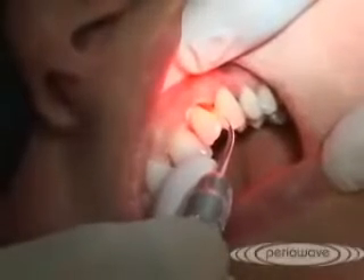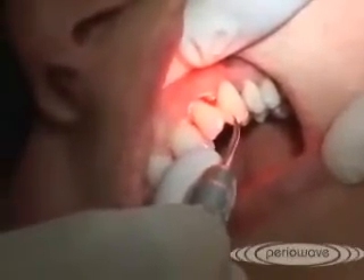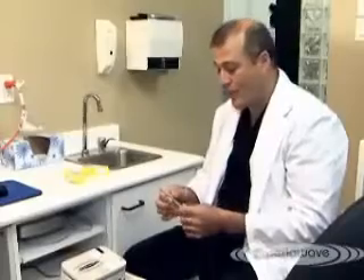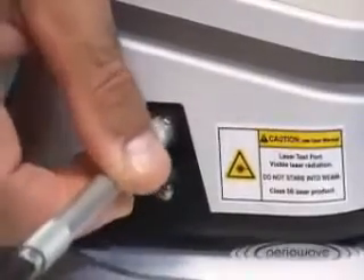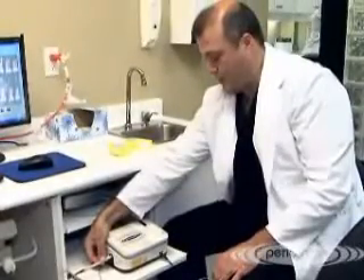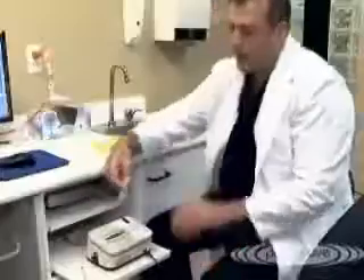In order for the PerioWave treatment system to operate properly, the light diffusing tip must deliver the correct level of illumination. Therefore, it is recommended that the system be cleaned and tested after each treatment. The way that is done is without the diffuser tip in place — the wand is placed in the side port of the base station, and the foot pedal is depressed. What we are waiting for is the upper green light to stop flashing. That concludes the test to ensure that the power coming out of the tip to the diffuser, ultimately to the patient, is adequate to activate the photosensitizer placed below the gum line.